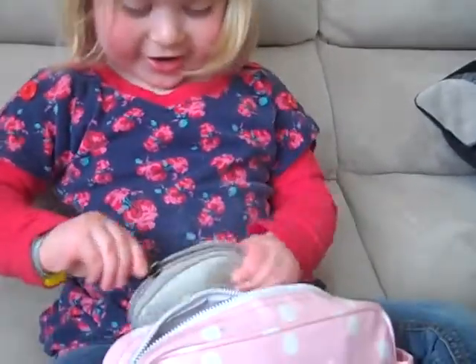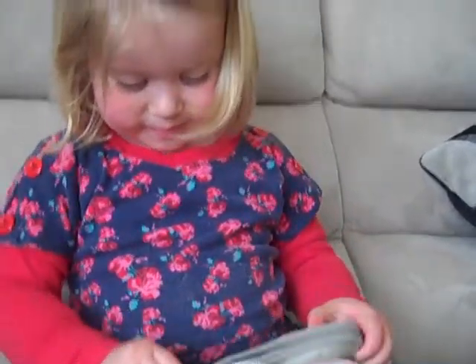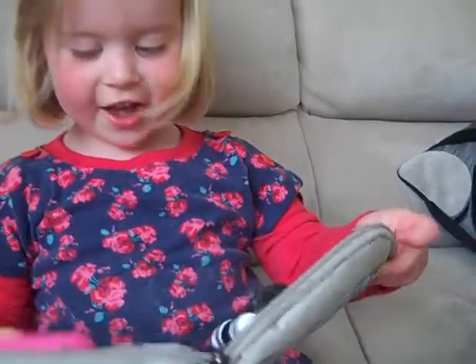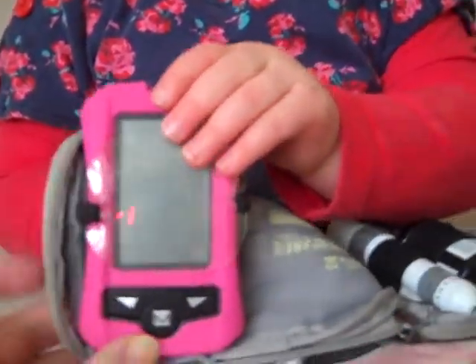My blood sugar. Your blood sugar. Hold it up so we can see - your meter. It's very pretty. It's pink, very girly. And over this side, your finger pricker and your test strips.